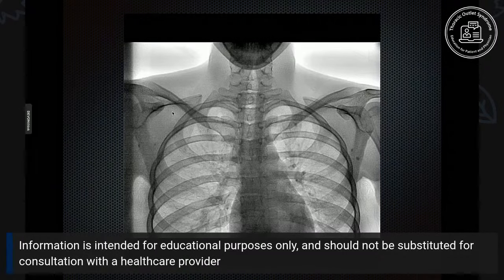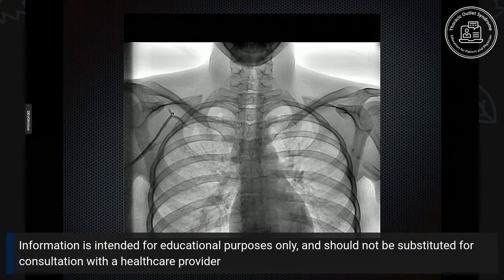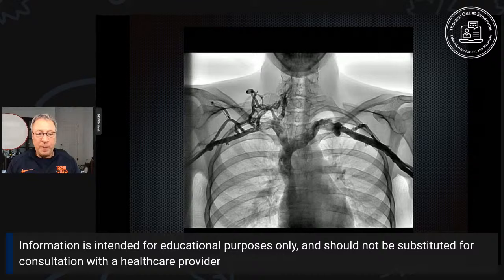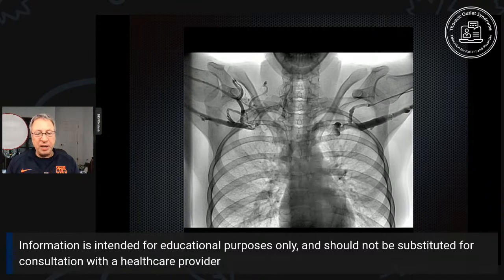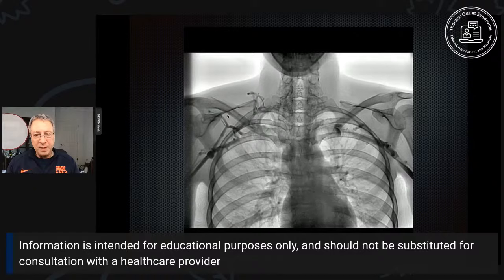And what you're going to see, the beating heart, and slowly the blood from the veins is going to come back towards the heart. All right, and you can see it flow in. You can see on the right there's a whole bunch of extra veins because when the patient raises their arms, there's compression. You can't see anything coming through that vein that's on your left or the patient's right. So this is pretty neat.